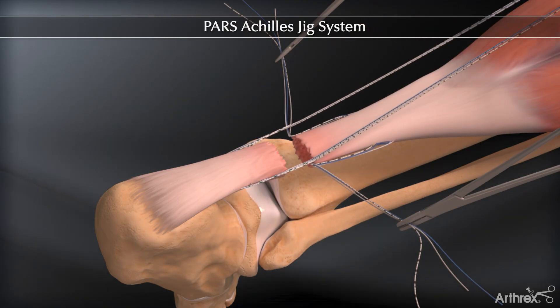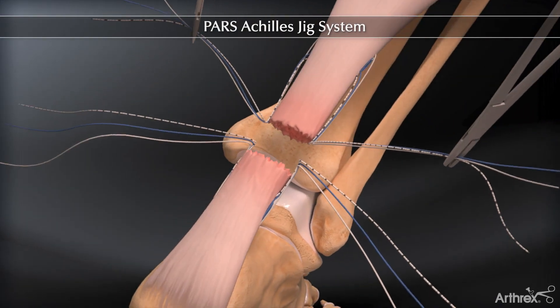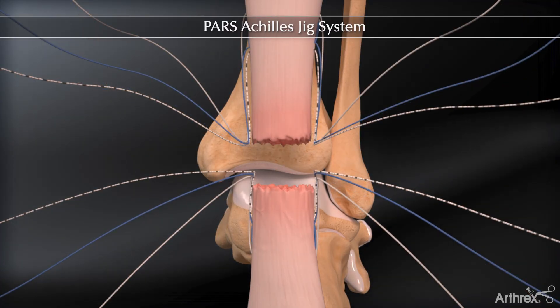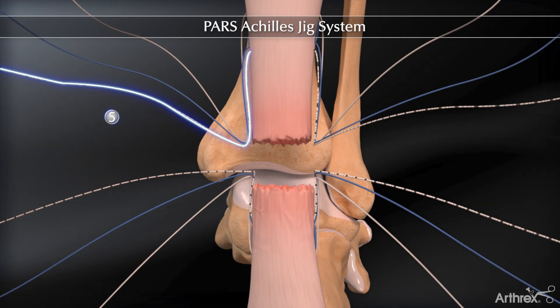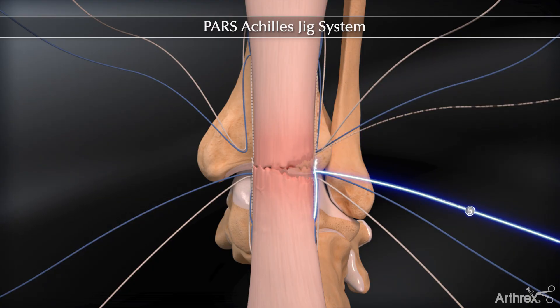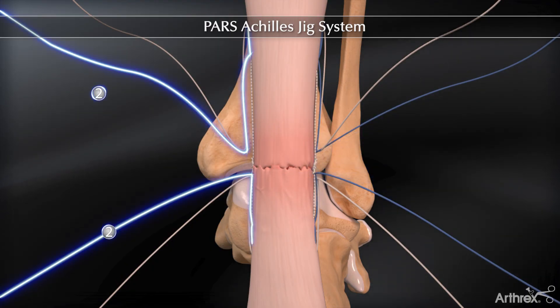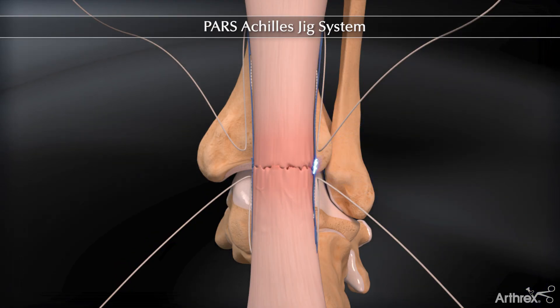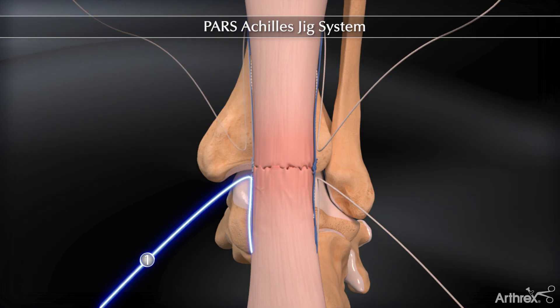Three sutures remain proximally and three distally, ready for re-approximation of the tendon. With the foot in maximum plantar flexion, tie the white-black suture on both sides of the leg first, then the blue suture, and last, the white suture.